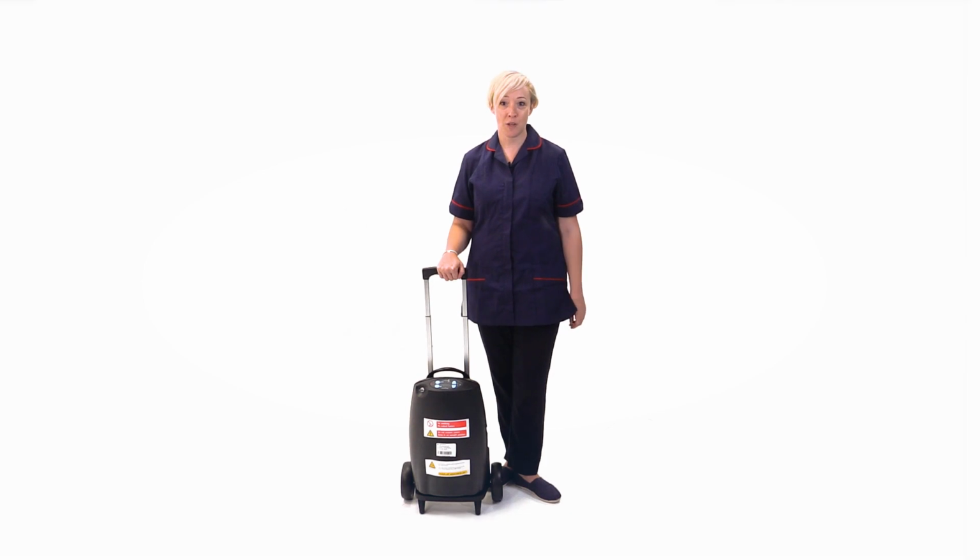You have been provided a transportable concentrator as part of your oxygen therapy. The transportable concentrator works by drawing in air and separating the oxygen from the other gases using a filter system. Oxygen is then delivered to your nasal cannula or face mask for you to breathe. The transportable concentrator is small and lightweight and is capable of delivering in both pulse dose mode and continuous flow. This kind of concentrator is ideal for travelling and getting out and about.